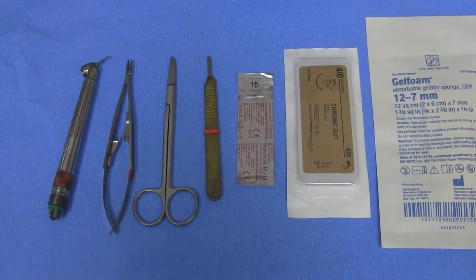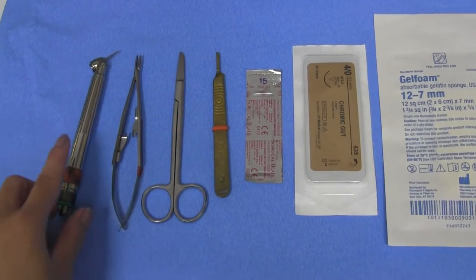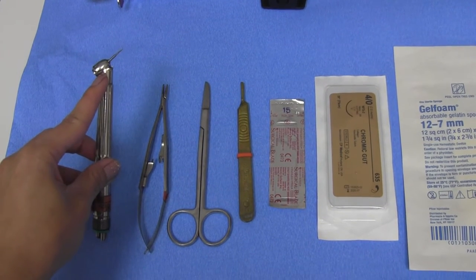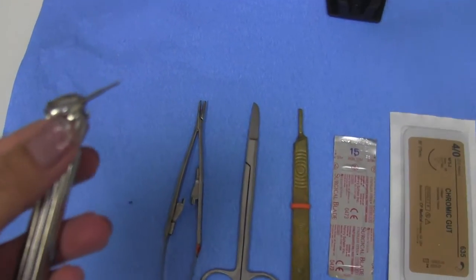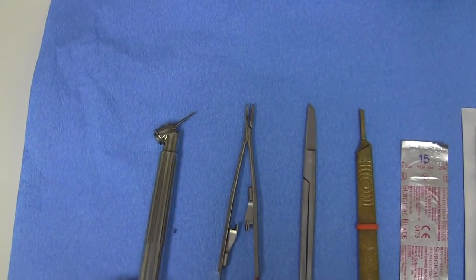Some other items you want to also have in the room but can keep bagged in case we don't need them is a surgical handpiece. If you look at the surgical handpiece, you can see that the angle of the handpiece is really angled. You will also need a long 557 burr, which we call the surgical burr.